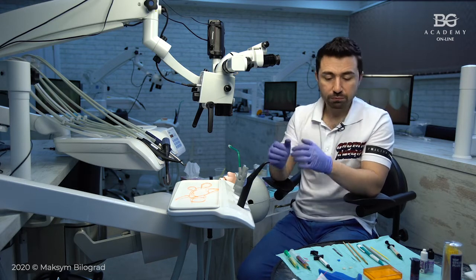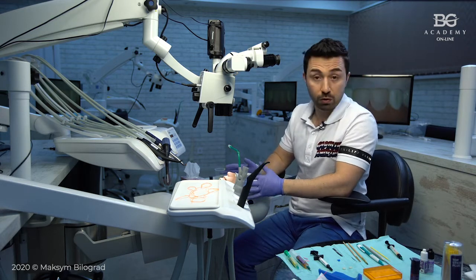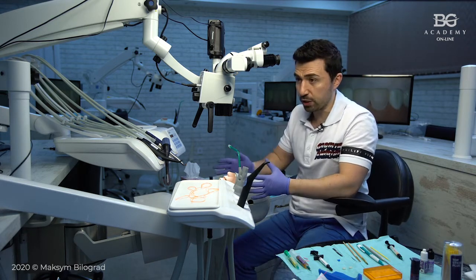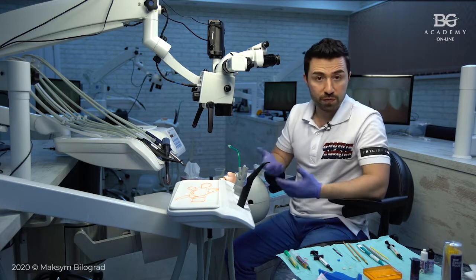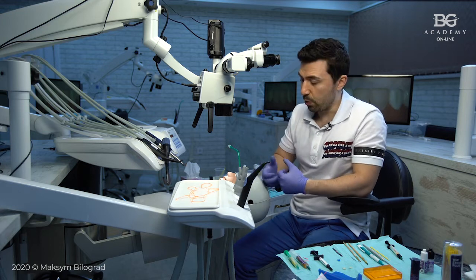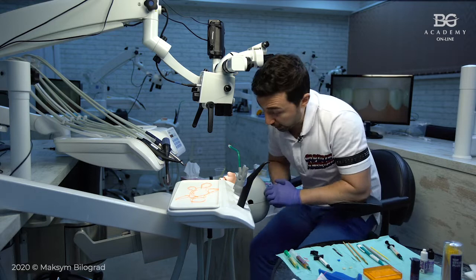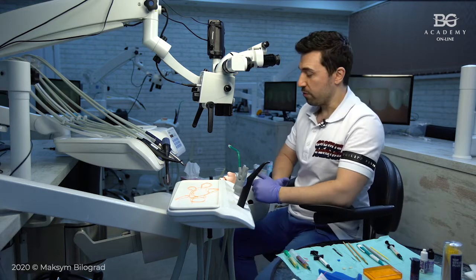Okay, so now let's imitate a real clinical situation. We have a patient that came with provisional restorations, and now we have to do try-in, and then we have to provide proper bonding procedures to get a really good and long-term result.